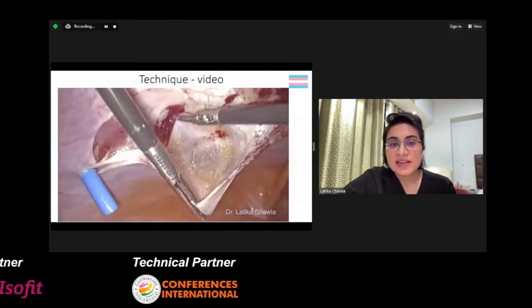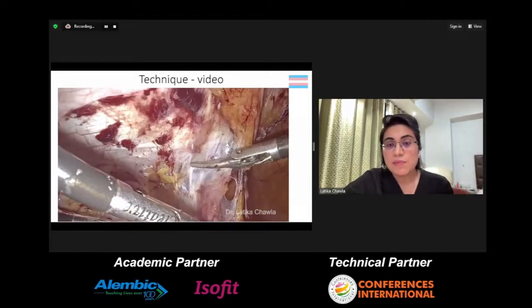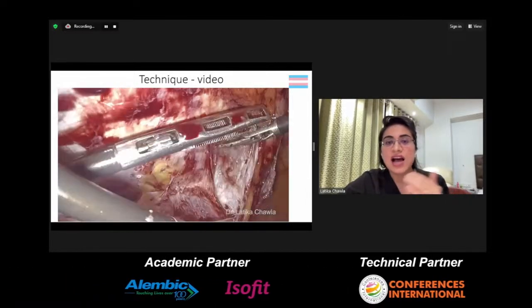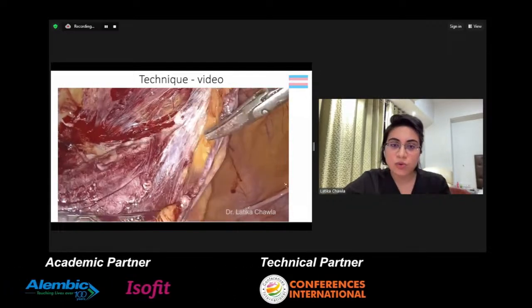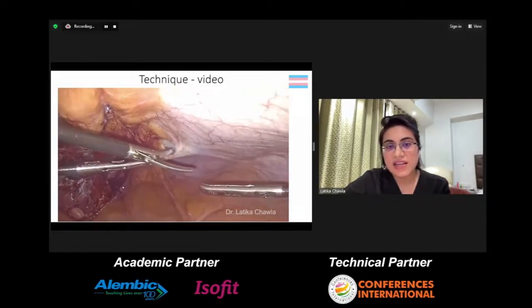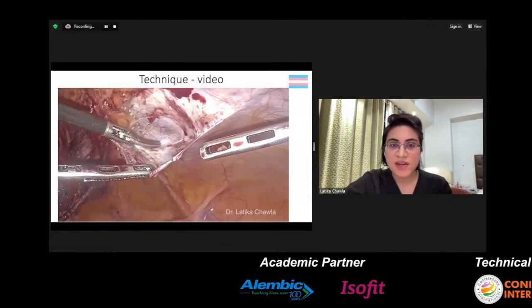If we use instruments like the ultrasonic scalpel, we have more advantage of the cavitation effects. It helps us open the preperitoneal planes in this case. And the intra-abdominal pressure here, I've kept around 10 millimeters of mercury because if the pressure is higher, then it doesn't allow us to give a counter traction to pull the peritoneum down while we're dissecting in the plane. After dissecting on the left-hand side, I have repeated the same procedure on the right side. The idea is to get at least 20 to 25 centimeters of peritoneum.